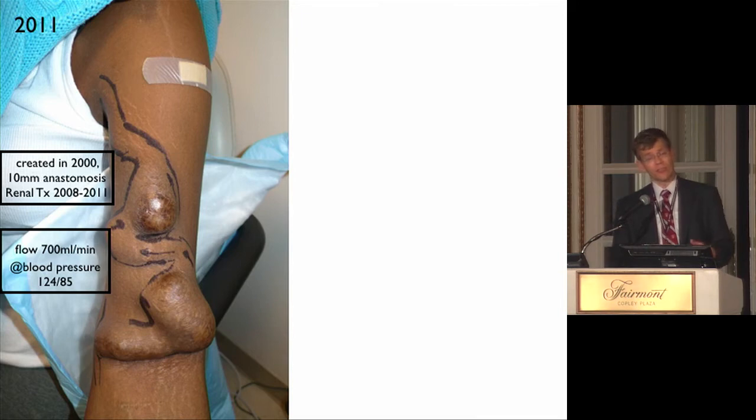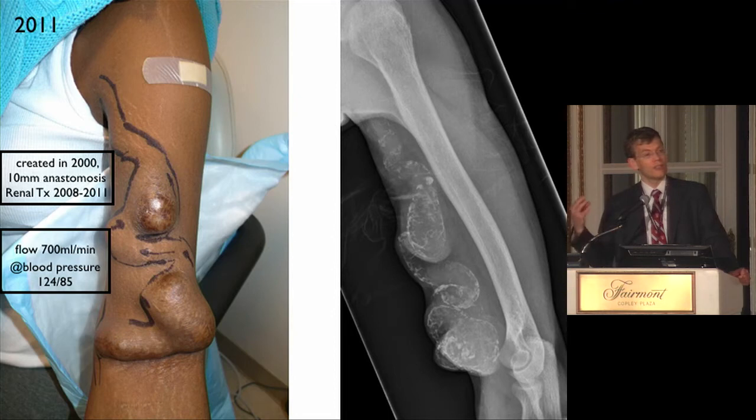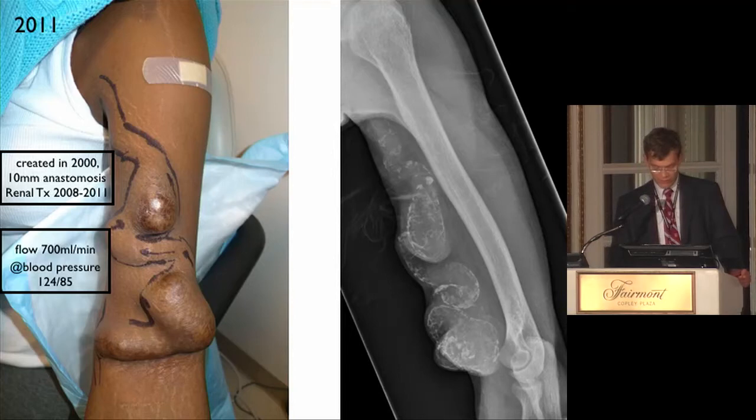Other pressure-related changes over time can manifest like this. So you have an access here created before transplantation. The access is not used, and then the transplant fails, dialysis is reinitiated, and there was an outflow stenosis, and you can see that the access under this continued high pressure ossifies. So there's a change of the cells, and they deposit calcium in the vessel walls, and this access is basically not usable anymore, because when you put the needles in, it crunches. There's a lot of resistance, and it doesn't have the elasticity to close off after needle removal.